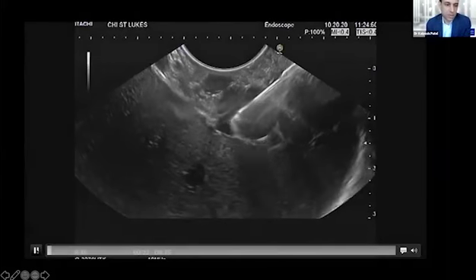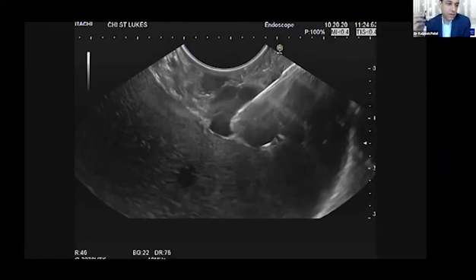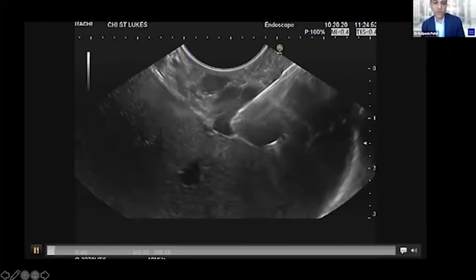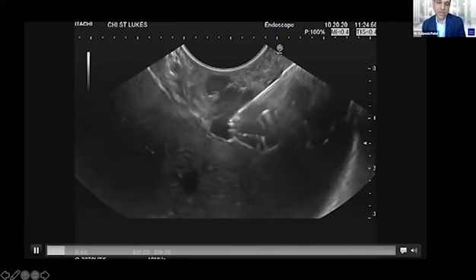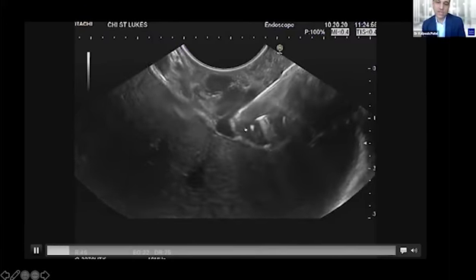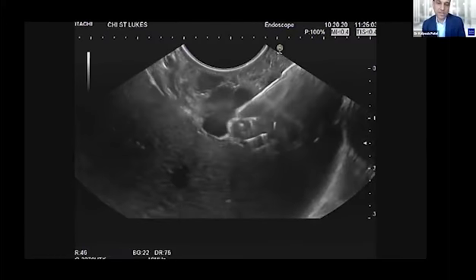And let me pause this for a second. I like to have the needle prepared for the first injection outside, without attaching it to the scope. Each subsequent coil, the needle remains on the scope, the needle in the varix, and we're basically repeating that function with the needle on the scope. Here's the EUS view. Here we can see a needle puncturing a typical varix, and as that coil comes out, you can see it very nicely begin to take its shape within the varix itself.